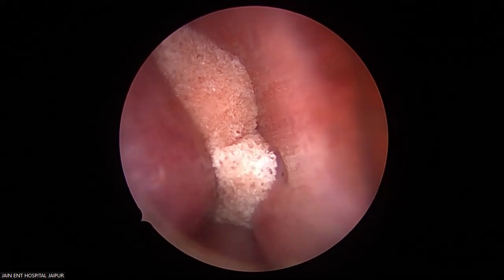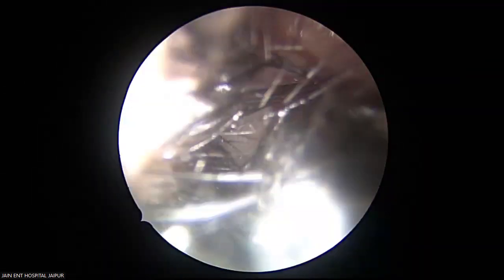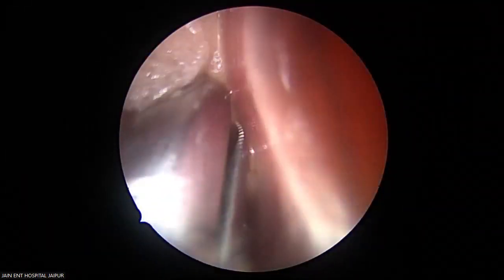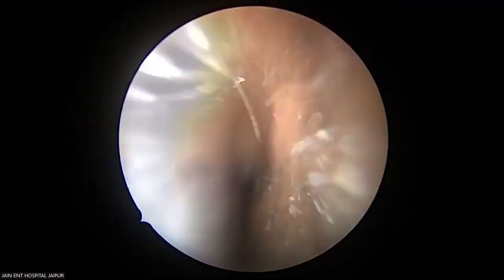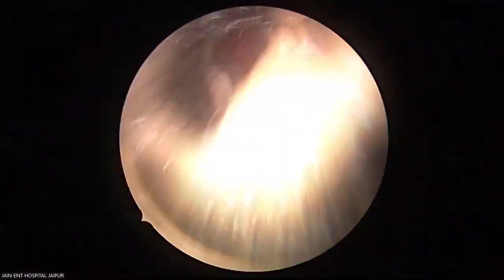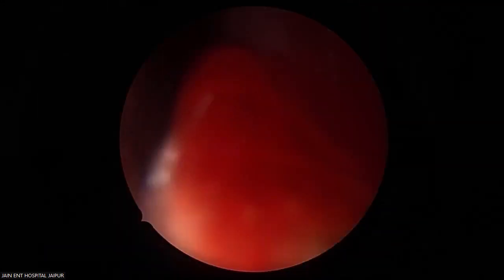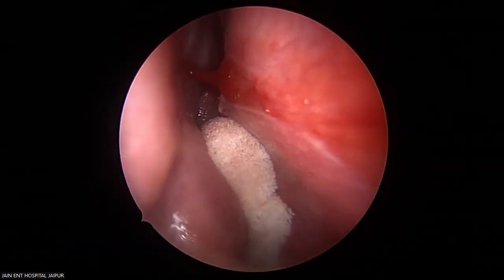So here, a couple of minutes will decongest the surface. This tumor looks very vascular. I could see the arterial ramifications within the tumor, extensive ramifications. Looks very, very vascular. Let's see. You are putting this adrenaline with Merocel. Yes.